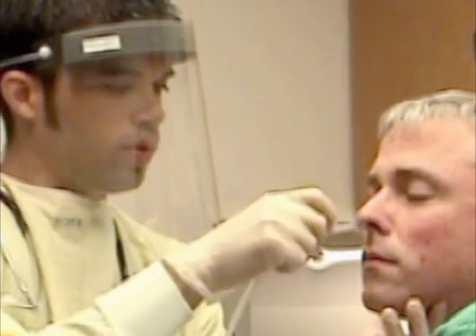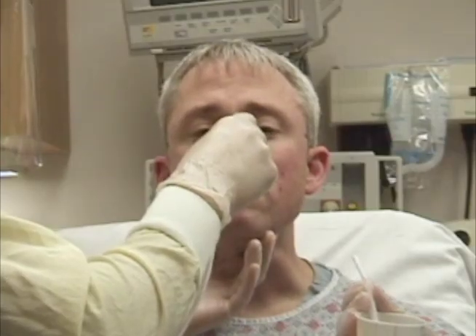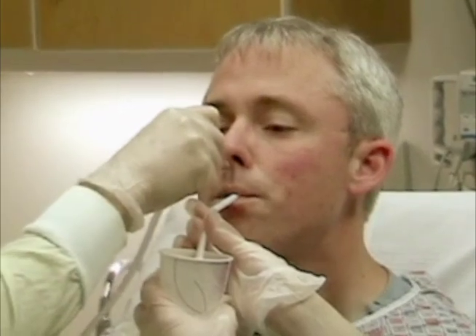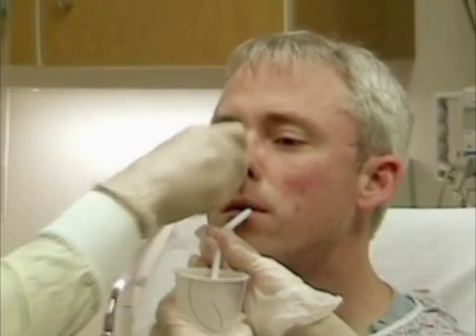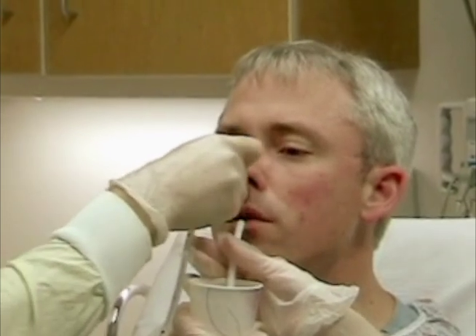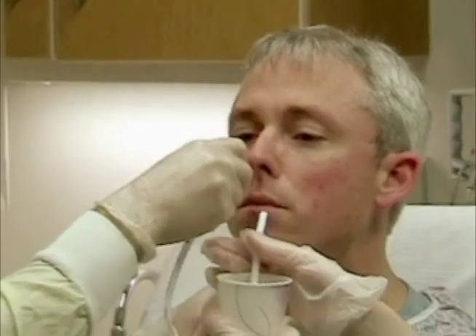Continue to pass the tube posteriorly. The patient may gag once the tube reaches the larynx. Temporarily halt the advancement of the tube and ask the patient to begin swallowing sips of water through a straw. Coordinating advancement of the tube with the swallowing mechanism facilitates passage of the NG tube into the esophagus and prevents entry into the trachea. This is a fluoroscopic view of a nasogastric tube being inserted.